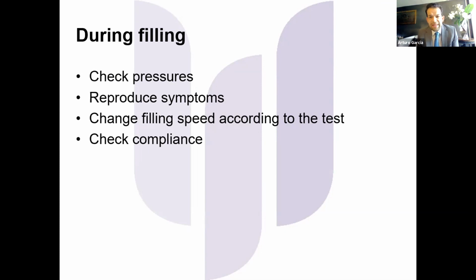No, we need to stand them up, we need to crouch, we need to reduce the prolapse in order to look for this stress incontinence, because this is the main aim of urodynamics. Maybe we ask the patient to cough, and the cough makes the bladder have a detrusor overactivity wave, and that's what makes them leak.